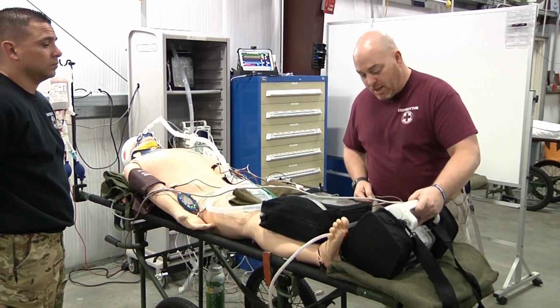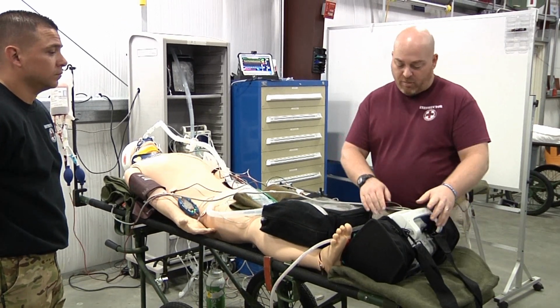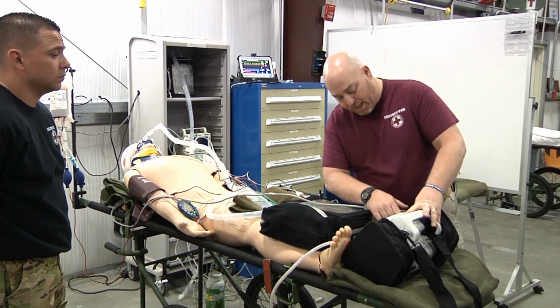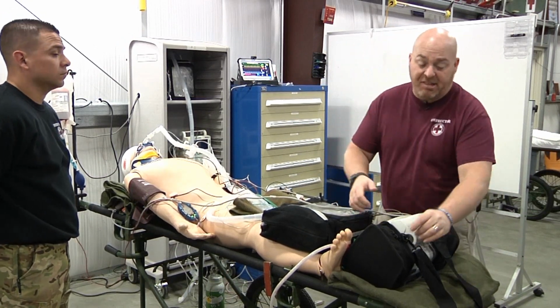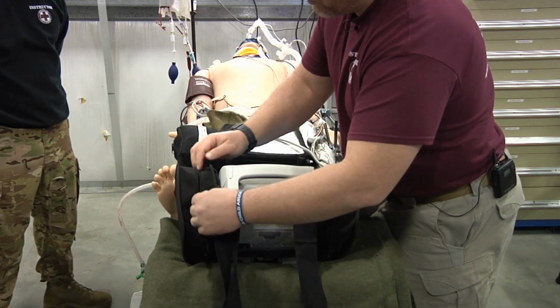All right. Now we've got our patient hooked up on our monitor. We've got the end-tidal on. So I'm going to come here. I'm going to hit the CO2 button. And what that's going to do is it's going to initialize and zero my end-tidal for me.